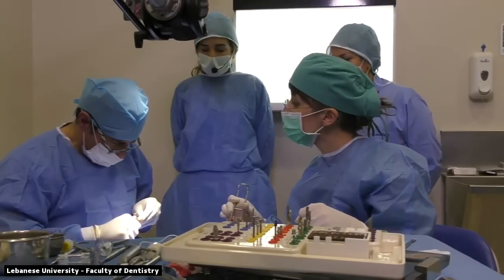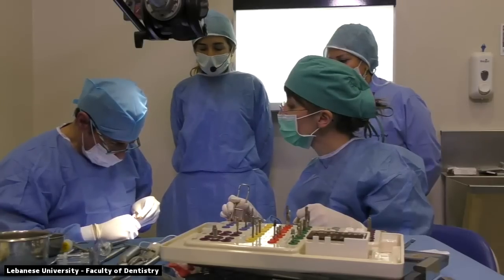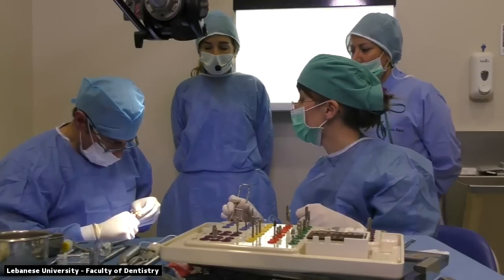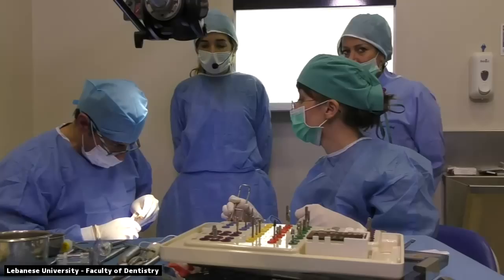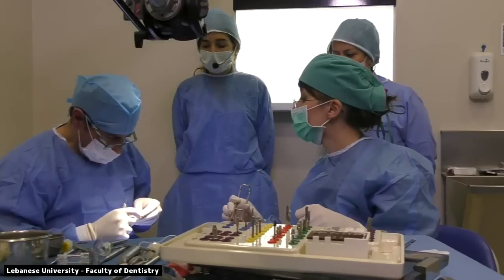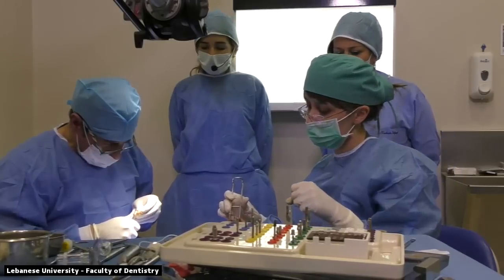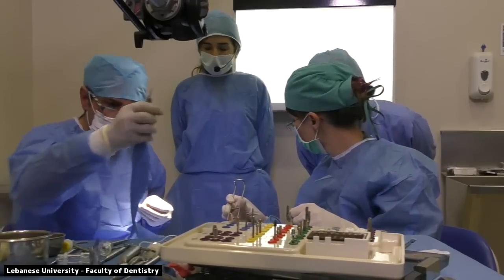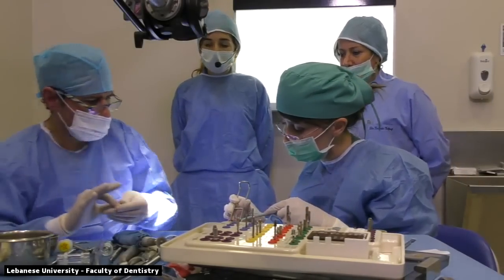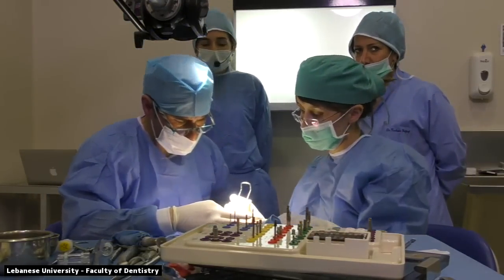So the embrasures are being adjusted at this moment using the disc. This will create a sufficient contact area for the papilla to grow and to give us a proper emergence profile of the soft tissue, scalloping of the soft tissue, the gingival margins, and the papilla site. So always consider that the zenith point at the central incisor is slightly distal to the midline of both central incisors. So once we place our temporary restorations, we need to adjust to that fact as well.